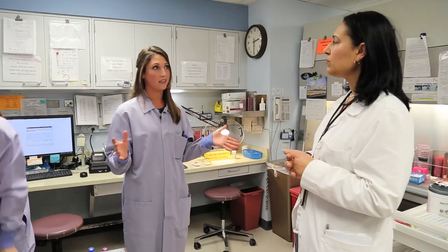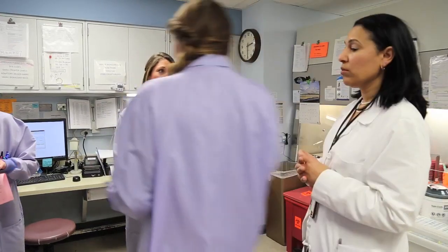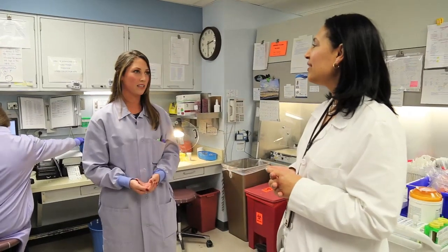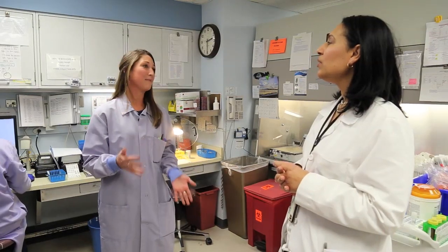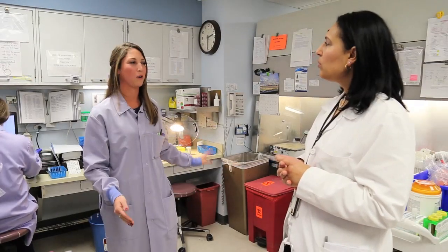An issue we have is that most floors send everything to chemistry first, so core lab, the main lab. However, chemistry batches everything until they have a full bin and then they send it to us. So sometimes doctors get upset that they said they sent something a while ago, but we haven't received it, and that's because chemistry still has it. We actually don't have it in our lab. So they either have to be lenient about that, or if they want to send it directly to us, we have our own tube station and they can do that. It's just that they know that one better.